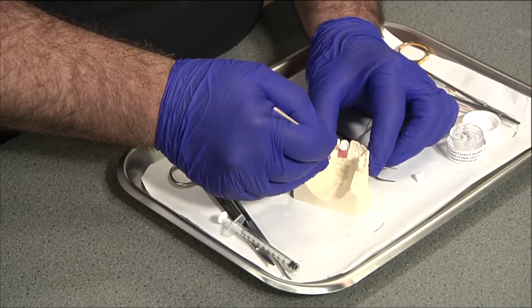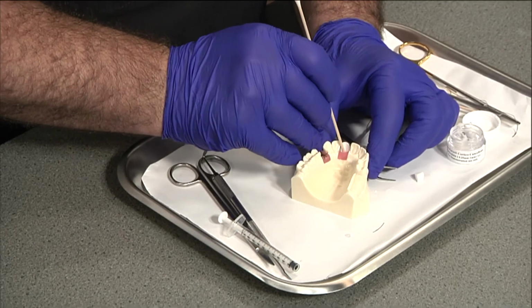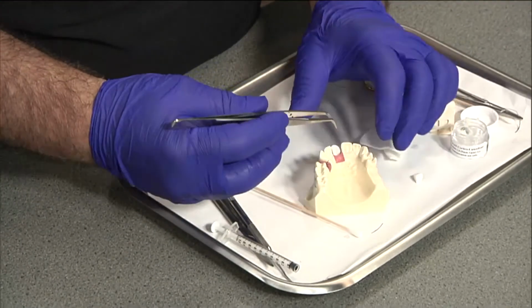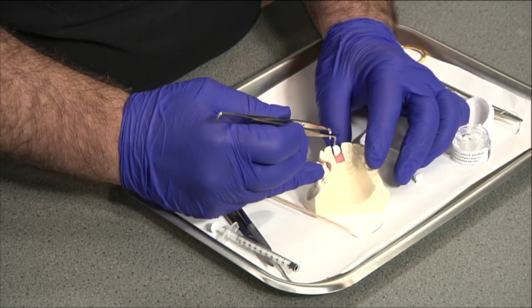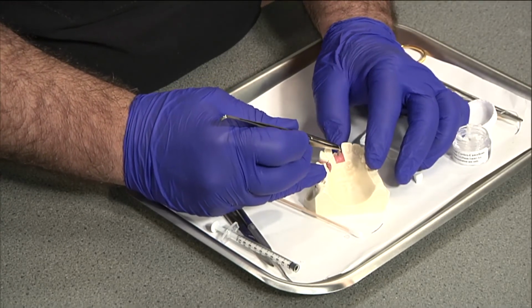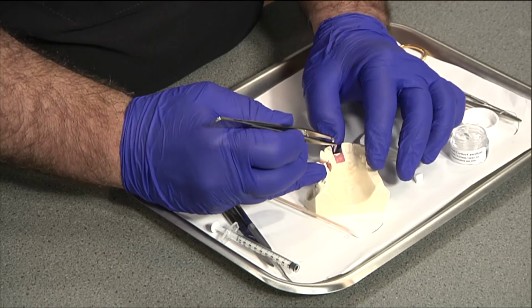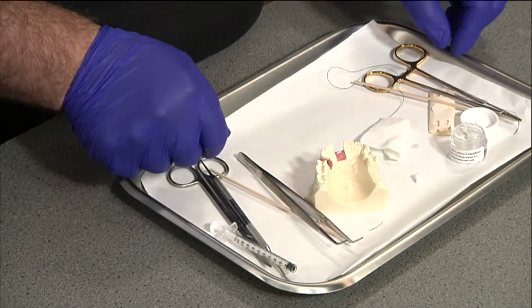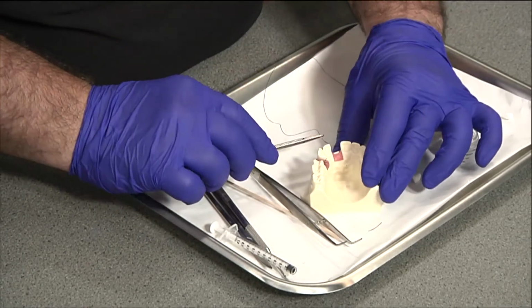Sop up the excess, gently place it, condense, add more and more, and then you get to the point where you have it to the level of the crest. You fold this over, gently tuck it underneath the lingual gingiva, and then you place your sutures.